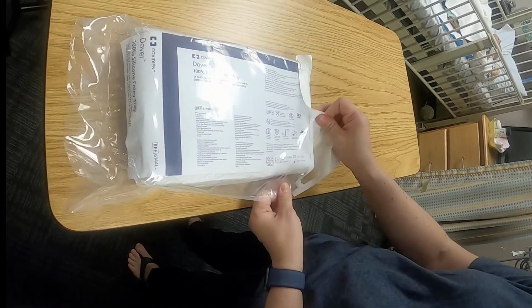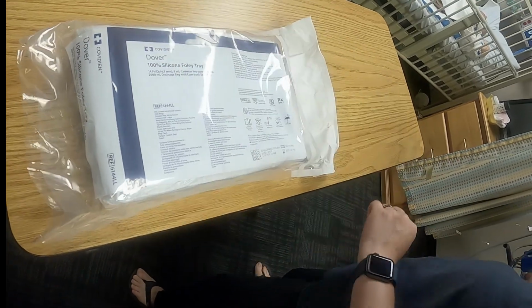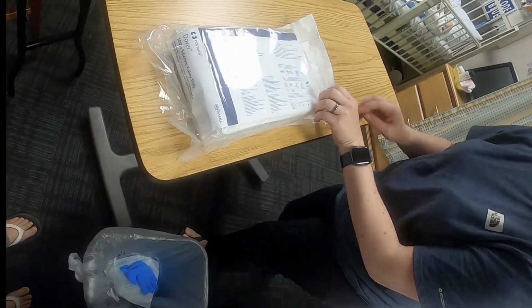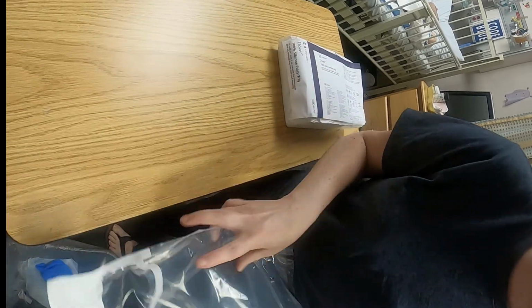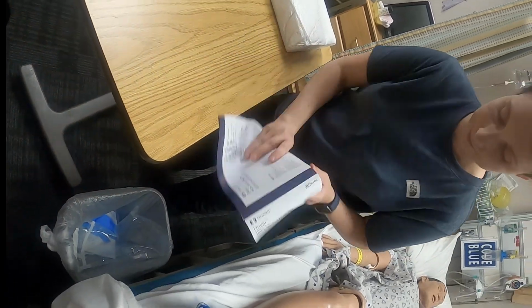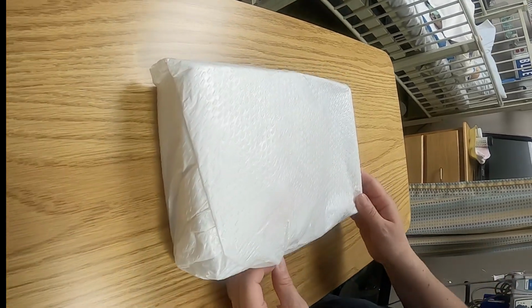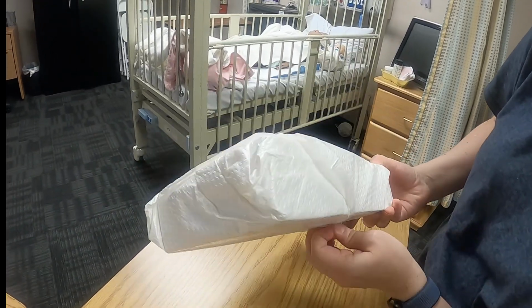Okay, I like to have my trash can over here too. I know some of you have learned to utilize your bag. However, I don't really like to use my bag for my trash. Okay, I just like to put everything into the trash in itself. Okay, so when I set up my sterile field, it's all nicely tucked in. Oh, this one here even has tape. Look at that.